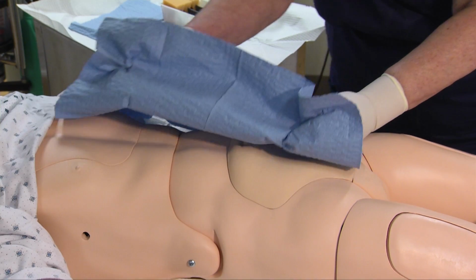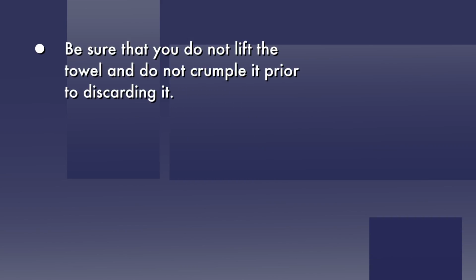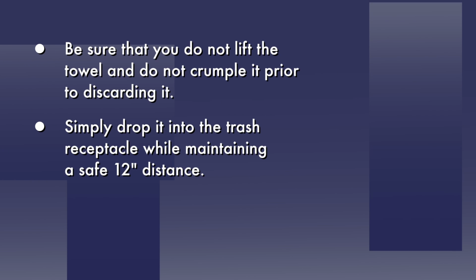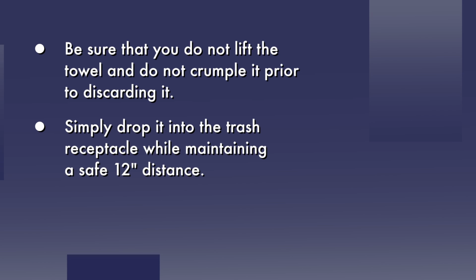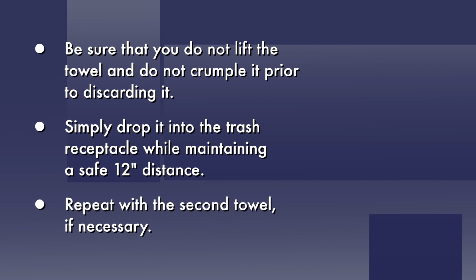Pinch the far edges of the towel and peel it toward you to remove and discard it. Be sure that you do not lift the towel and do not crumple it prior to discarding it. Simply drop it into the trash receptacle while maintaining a safe 12-inch distance. Repeat with a second towel if necessary.